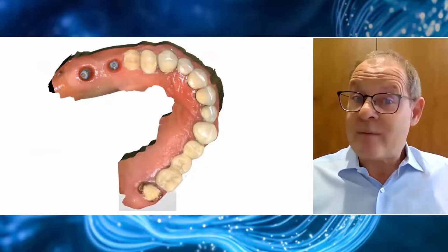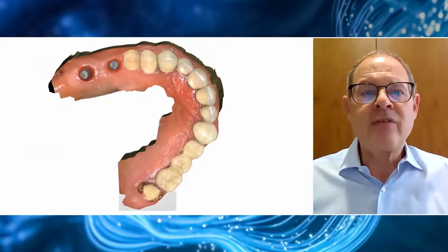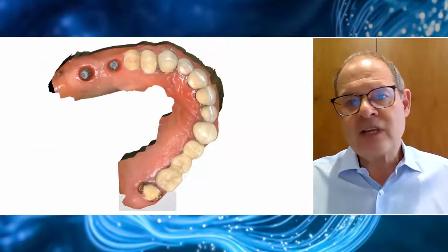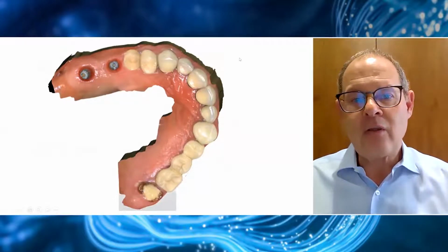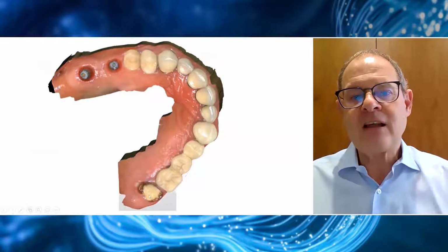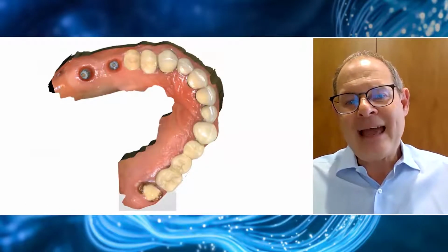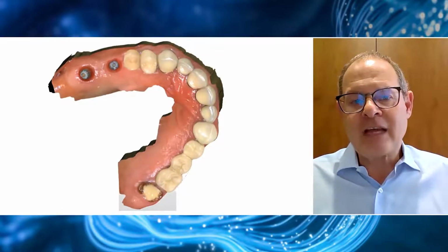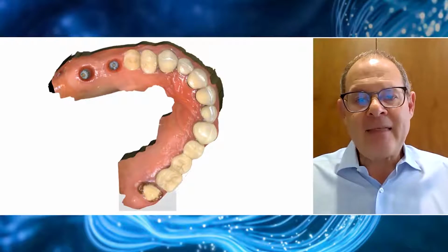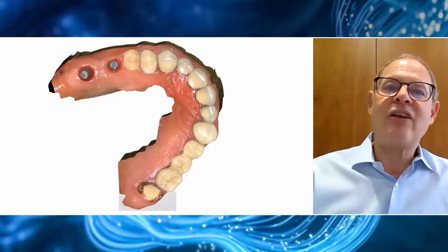And it also blew the patient away for its quality and its clarity, both of the implants, the mucosa, and the dentition. And in fact, if you look on the contralateral side, you'll see here the upper left last standing molar has been fractured at root level. And that, I'm afraid, was the tooth that got ripped out with the analog impression.